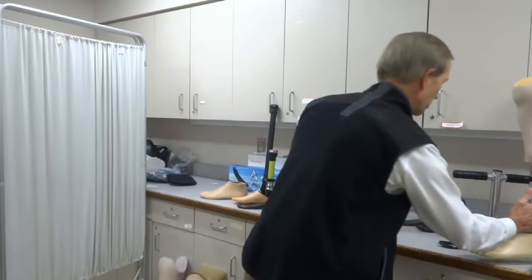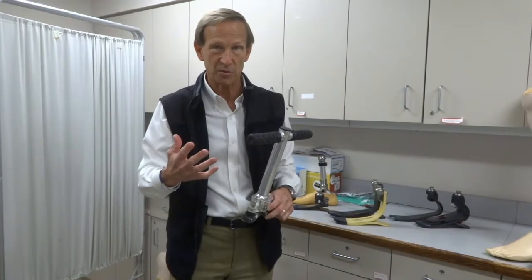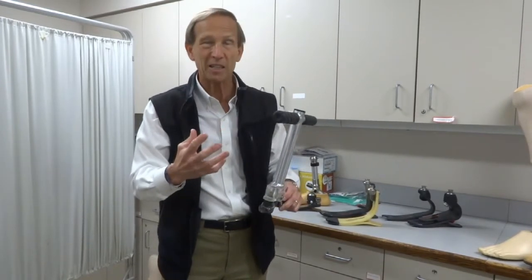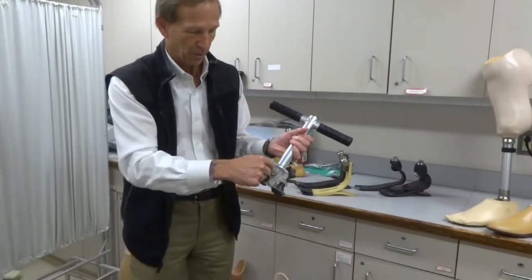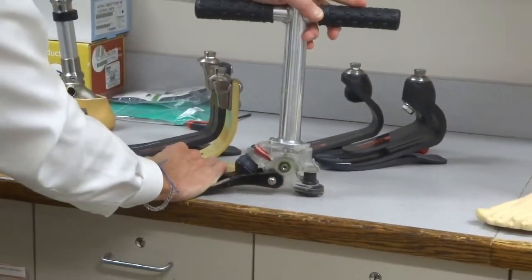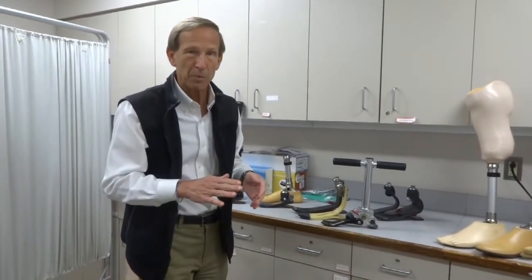Once you start to go outdoors, you encounter uneven terrain — lumps and bumps, little hills and inclines. Now we have a couple of choices. There are what we call multi-axis feet, which will not just go up and down but will tilt a little bit side to side and even rotate a little bit. This particular foot has multiple rubber bumpers at the heel and front half around the ankle joint to allow motion going up and down, tilting, and rotating. That rotation is important for activities where you might plant your foot and twist, like tennis or golf.